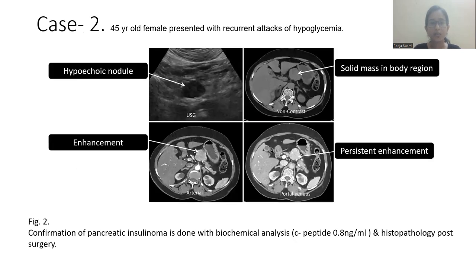Case 2: a 45-year-old female presented with recurrent attacks of hypoglycemia. On ultrasound, we can see a well-defined hypoechoic nodule. On non-contrast CT, we can see a solid mass in the body region. On arterial phase and portal venous phase, we can see persistent enhancement of the lesion. Confirmation of pancreatic insulinoma was done with biochemical analysis, including C-peptide, and histopathology post-surgery.